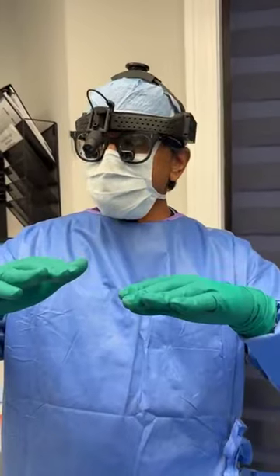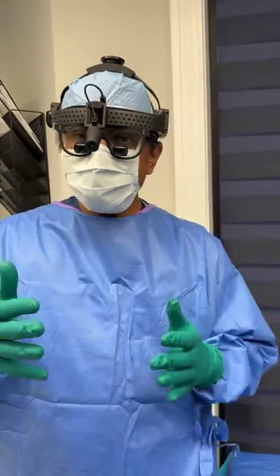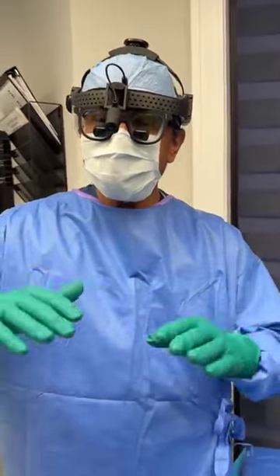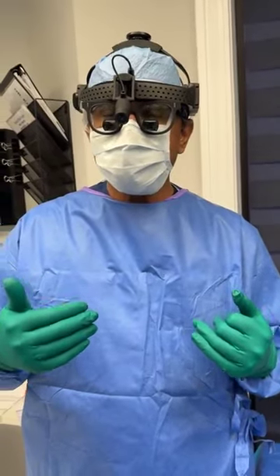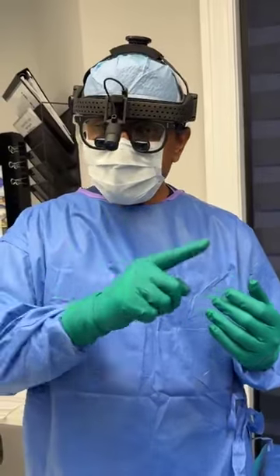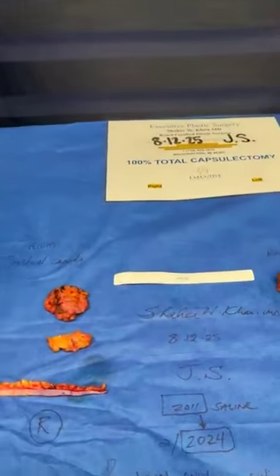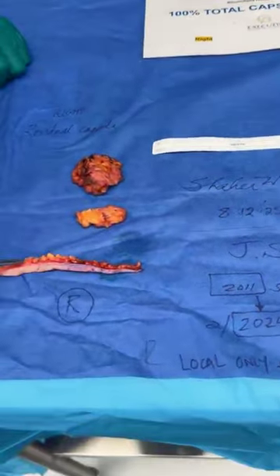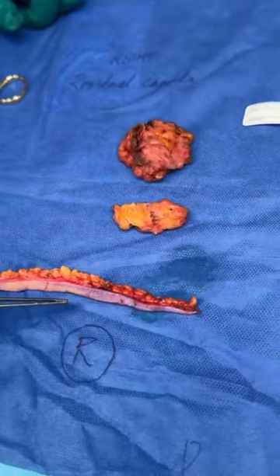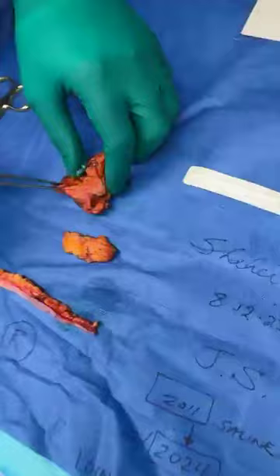Now remember, below the muscle is where the implant was and the capsule is. So the breast tissue above the muscle was not touched. I never touch the breast tissue in any of my explants because I don't need to. That's why I make only the horizontal cut. So as you will see, I cut out the surgical scar at the very bottom, and then this is the residual capsule that indeed clearly was there.